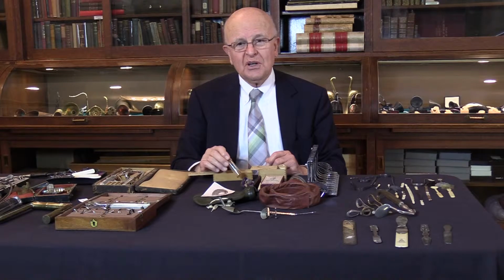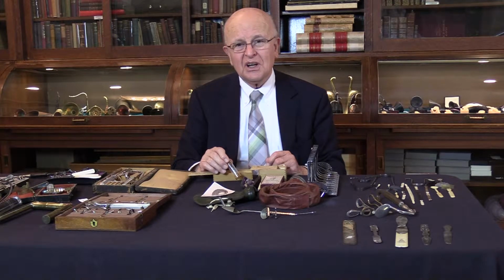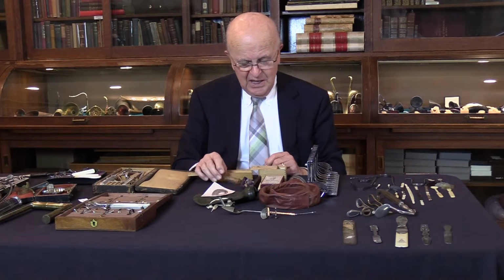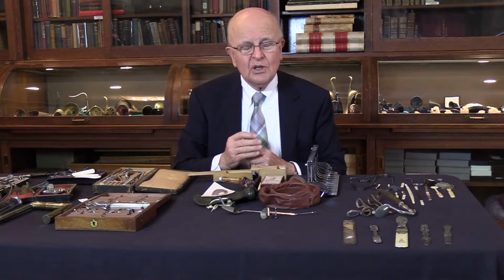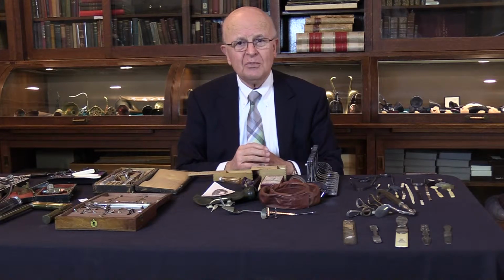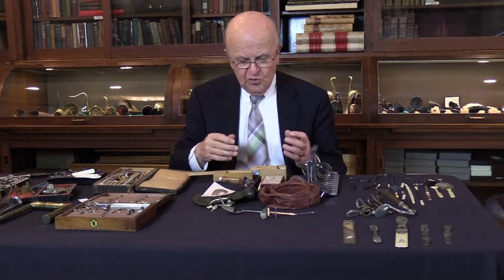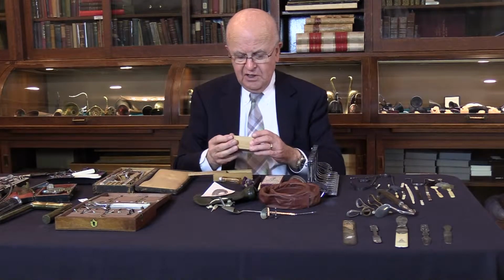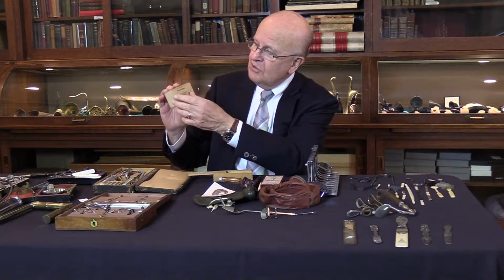I want to go over some of the otology devices that were used around the turn of the 20th century and late 19th century. People recognized, when they were able to see the eardrum, that a perforation of the eardrum is part of the problem: drainage, hearing loss, whatever. So there was a movement to get what they call the artificial eardrum. So this is one brand here, and you can see the artificial eardrum.